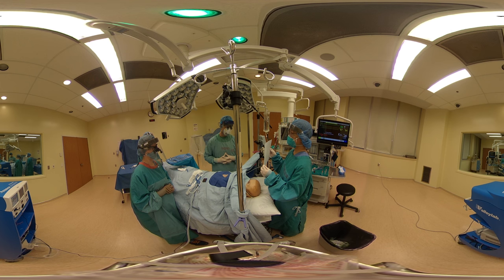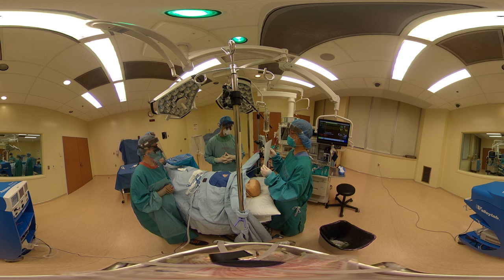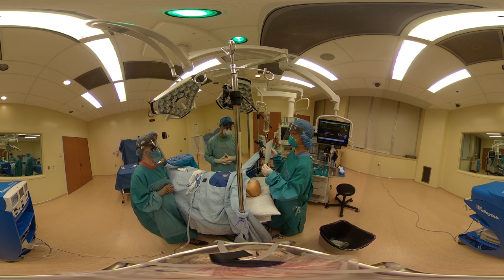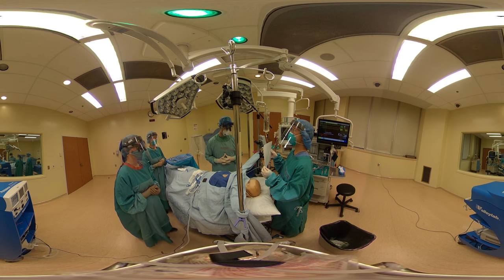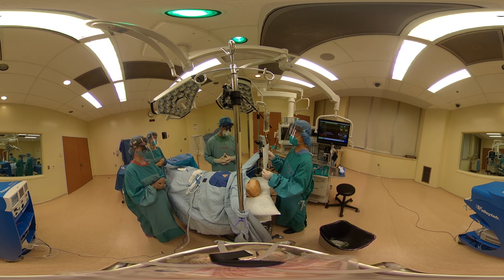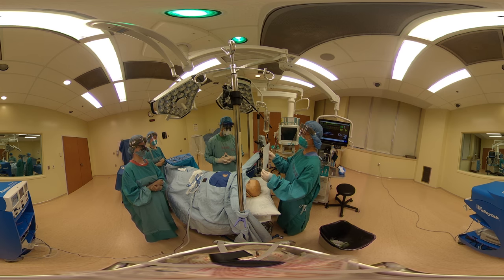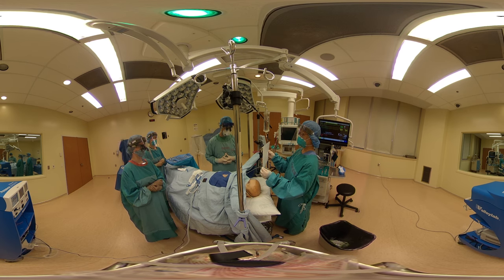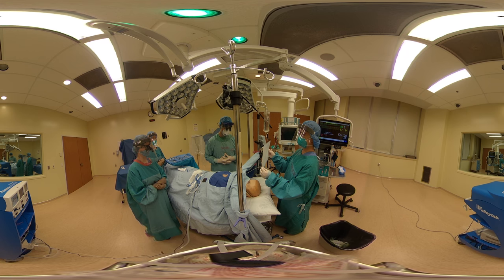Sight is marked. Myself and Dr. Polk will do the case. Patient is supine with neck extension. There is no imaging display, no special considerations. VTE prophylaxis has been appropriately administered. Any questions or concerns? No.